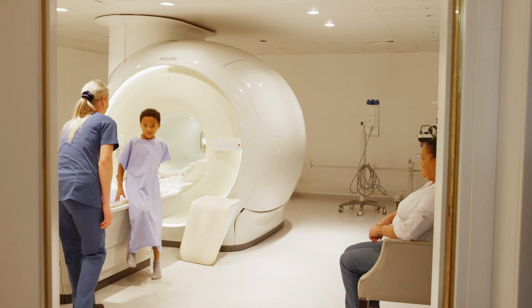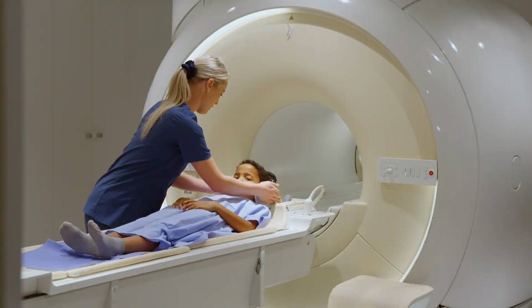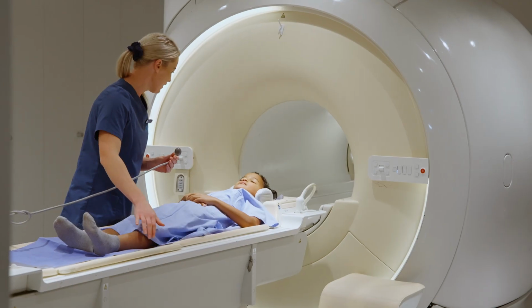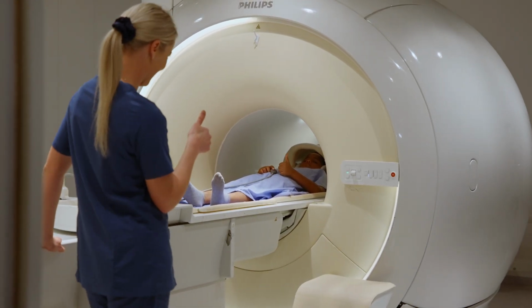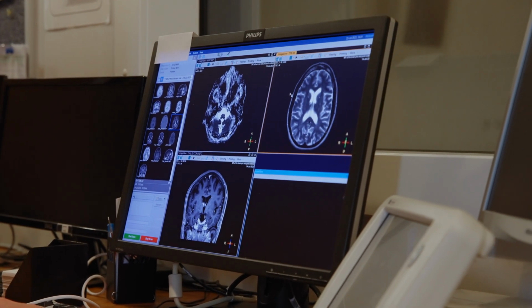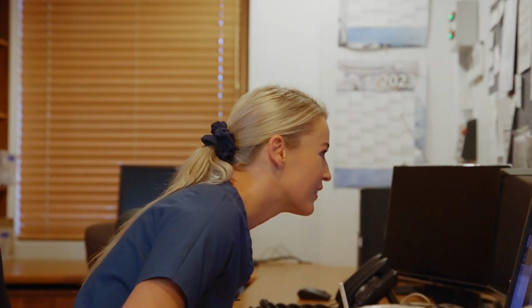Because of the loud noises of the MRI scan, we will make sure that you are fitted with earplugs as well as earphones to ensure that the noise of the machine doesn't injure your ears. We will also give you a panic button, which you can press at any time to let us know if there is anything that is bothering you. Once you are positioned, the radiographer will push you into the tunnel, step outside and conduct the rest of the scan from the outside. It is important to note that we will communicate with you from the outside via the earphones.